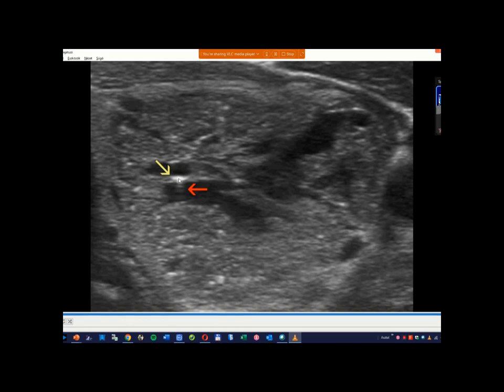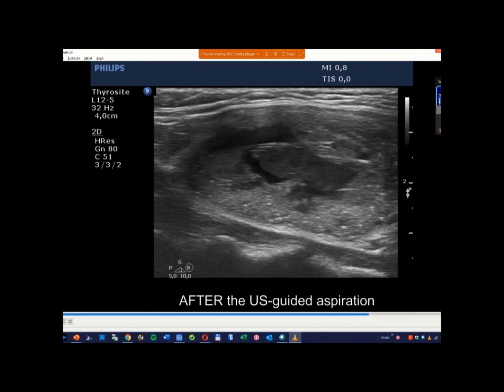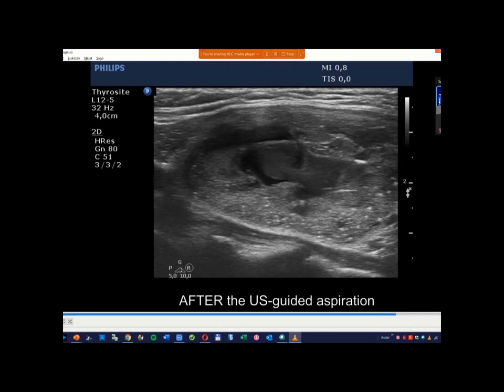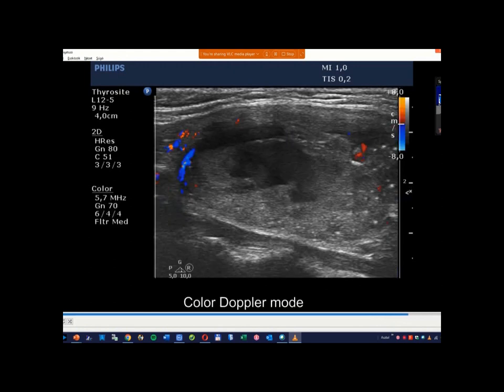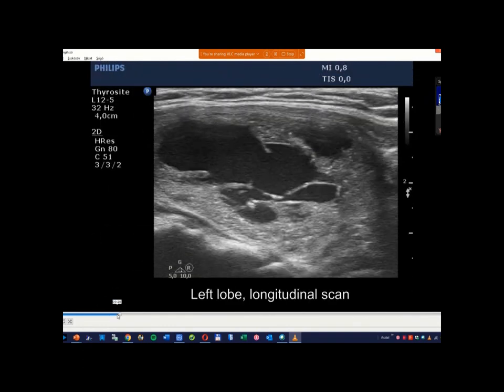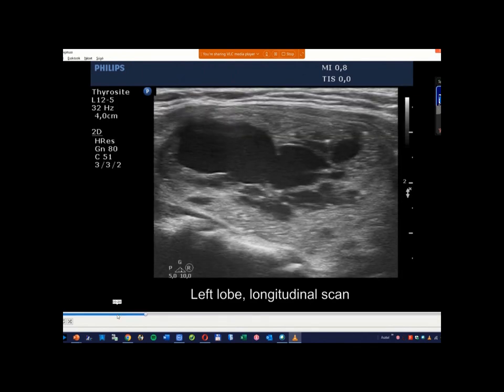So this pattern, and this is not within fluid, this is between two cystic chambers. And there are other parts of the nodule which can have comet tail artifacts, but this figure is clearly a comet tail artifact. Okay. For me, the distribution of the granules is not balanced, so they are not the same. Okay, I agree with you. So, I mean, the whole pattern is suspicious for me.